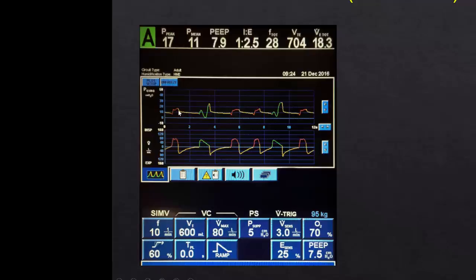because I mentioned in pressure support that pressure support can support the spontaneous breaths in IMV. So for example, the pressure support is set at 5, the PEEP is 7.5. So when the patient breathes on their own, they get pressure support up to around 13 or so.